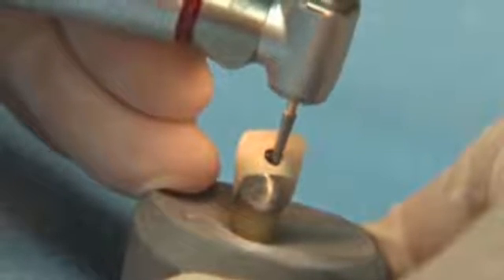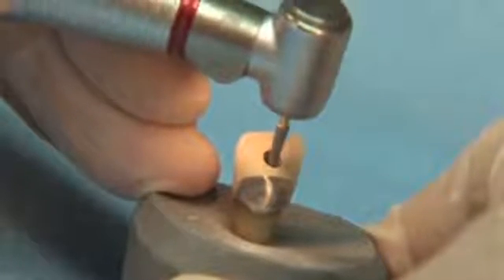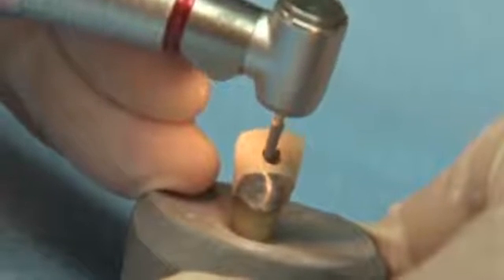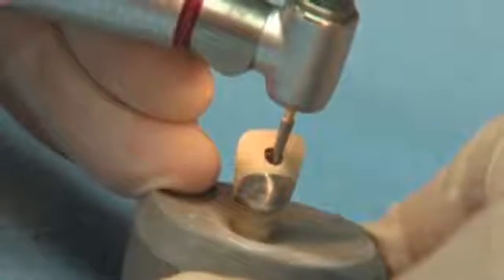EndoSafe End has no step at the tip. This burr will prevent ledging of the axial walls, and the RoundSafe End prevents perforation of the furcation areas.